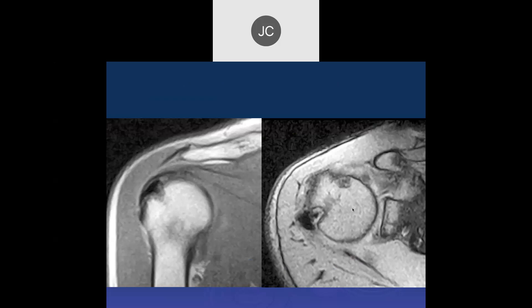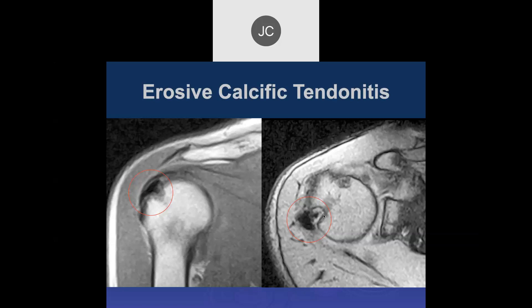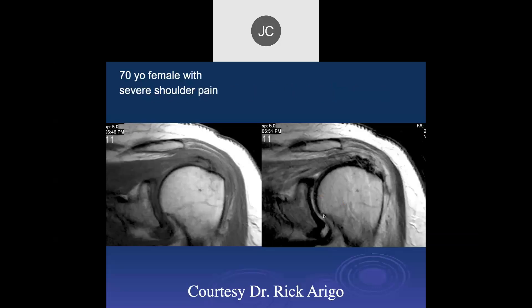Here we see low signal in the infraspinatus tendon fibers — again, calcific tendinitis probably, with erosive changes. This is on a low field scanner, a 0.2 tesla scanner.